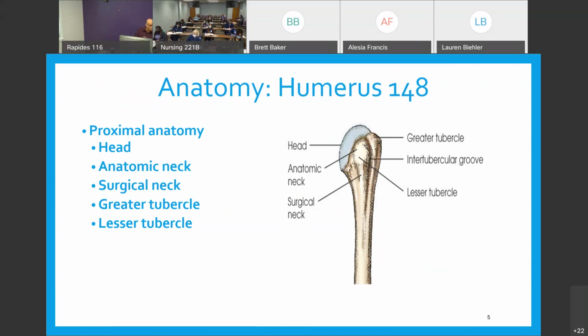You kind of know perpendicular and parallel with the epicondyles, right? Now you're going to need to tell us what happens to the lesser and greater tubercle as we put the epicondyles either parallel or perpendicular. Any questions? We already know the elbow part, right? We just need to incorporate now, with the epicondyles being parallel or perpendicular, what happens in the upper portion, the proximal portion of the humerus as far as the greater and lesser tubercle. One's going to be in profile and one will not be.